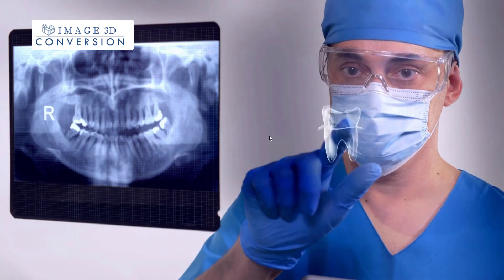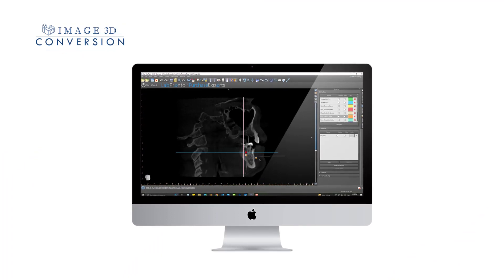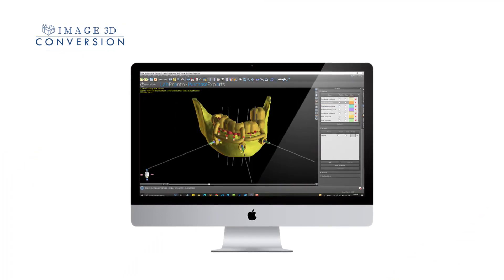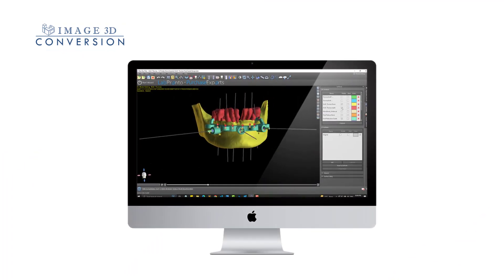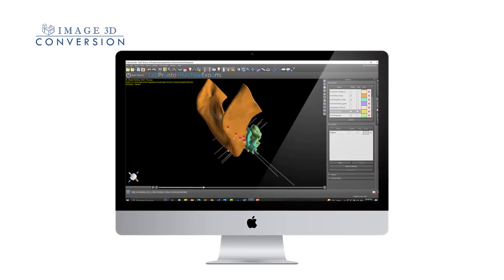Using advanced 3D imaging technology, our team of experienced clinicians and design experts create a virtual model of the patient's teeth and implants, subsequently producing the most accurate surgical stents for the guided surgeries, allowing dentists to plan the procedure with optimal precision.